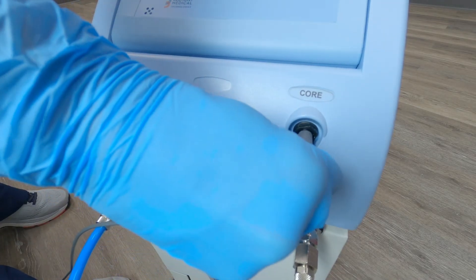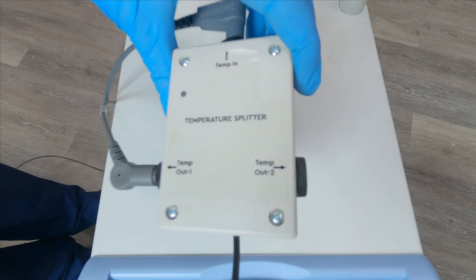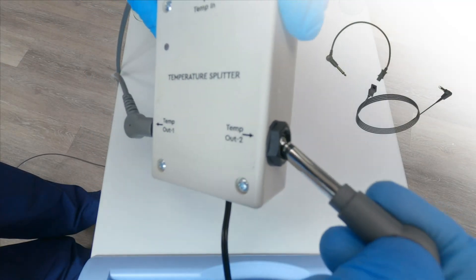Next, connect to the Olan or Criticool by repeating what we just did but on the other side, this time using temp-out two.